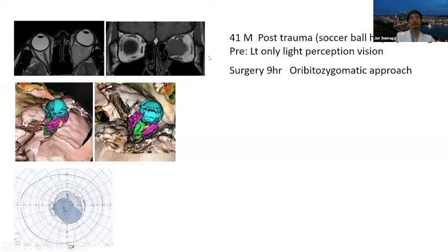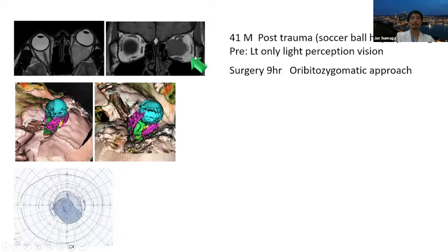In this case, I use the trans-orbital zygomatic approach because the optic nerve is in a position where this direction is very suitable. After surgery, his visual function improved. This is the same method — a zygomectomy with an L-shaped incision. Using a chisel, the L-shaped zygoma is removed and preserved. The temporal muscle is positioned inferolaterally, and a gutter is made to the orbital rim.